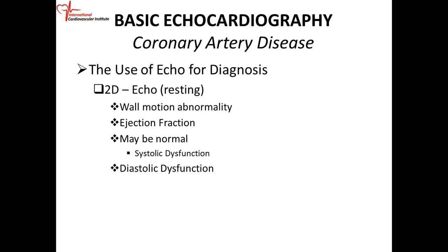But once the patient starts to exert themselves, the diastolic dysfunction gets worse. Your E/E prime ratio is going to go up, the PA pressure is going to go up, and the patient is going to have shortness of breath. So we can use that fact to do a diastolic stress test and show that the patient has worsening diastolic dysfunction with exertion. Okay, we'll go over that.